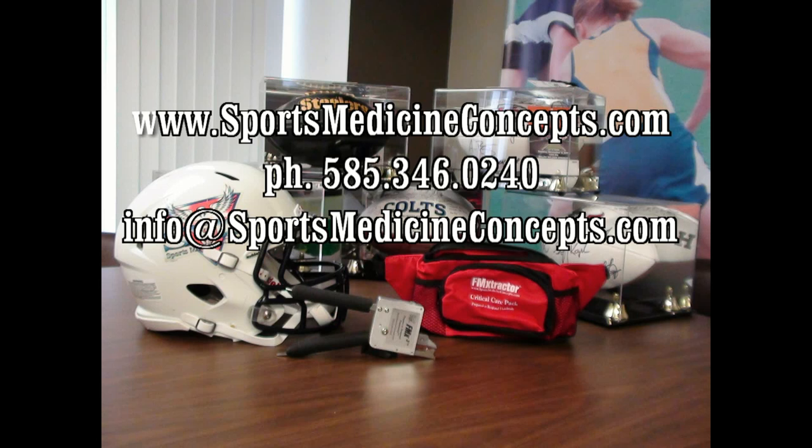Welcome to Sports Medicine Concepts Educational Series addressing using the FM Extractor to cut various football face mask fasteners. In this segment, we'll be reviewing face mask removal from the Revolution Speed Series Football Helmet.